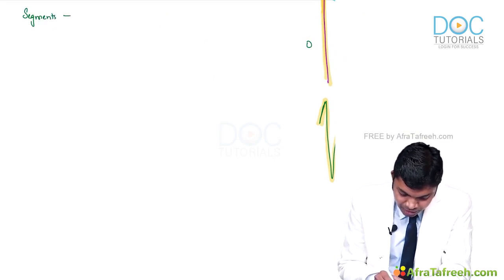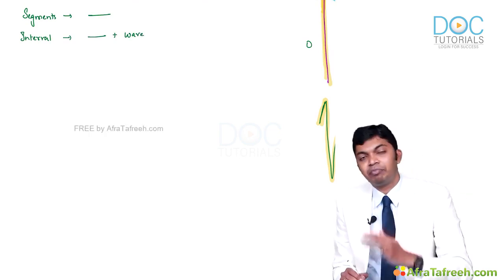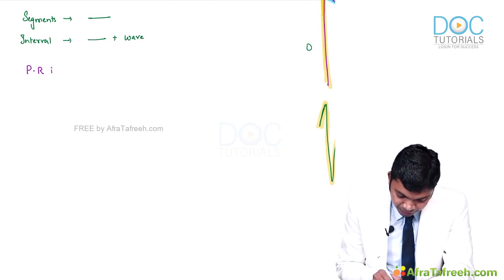Always remember, a segment represents a flat line, while an interval represents a flat line plus a wave, right, doctors? So, we will take up the very first segment or interval, that is the PR interval.